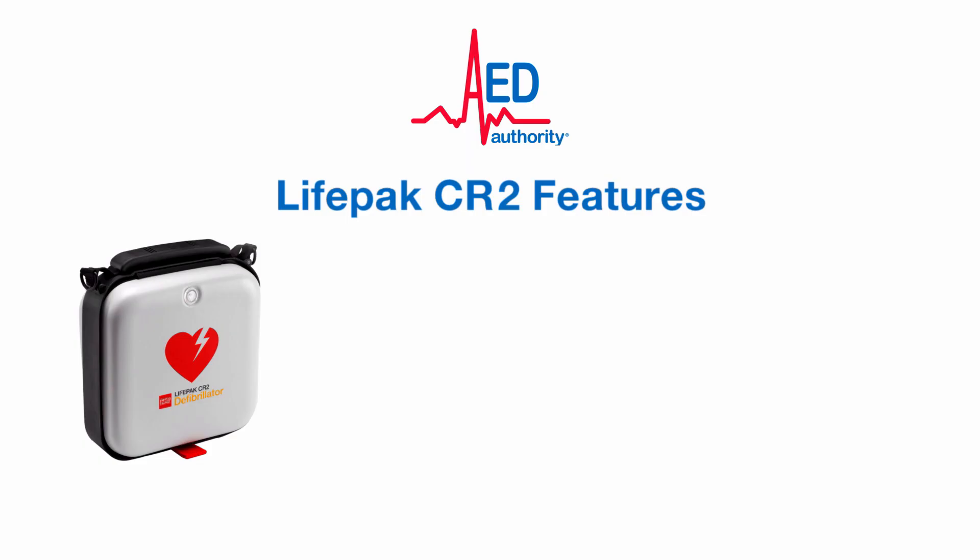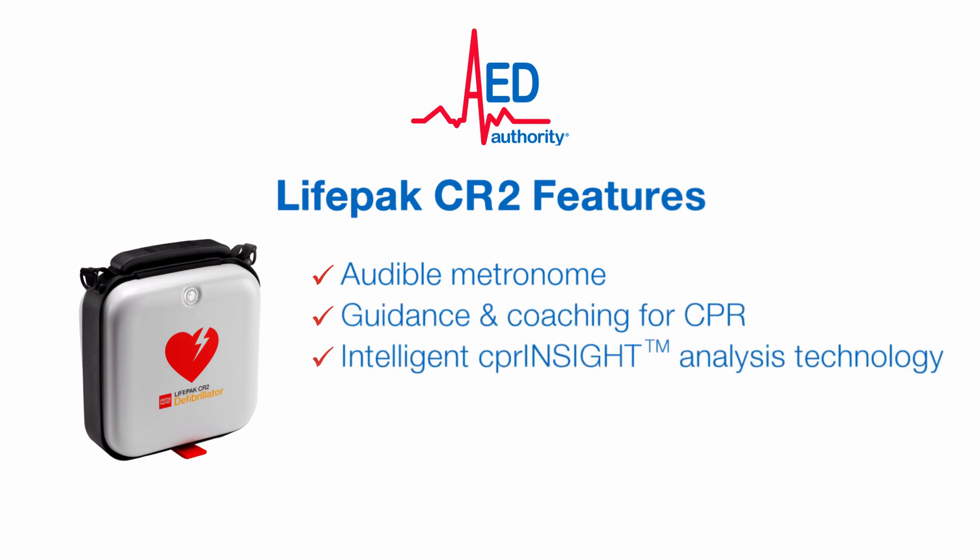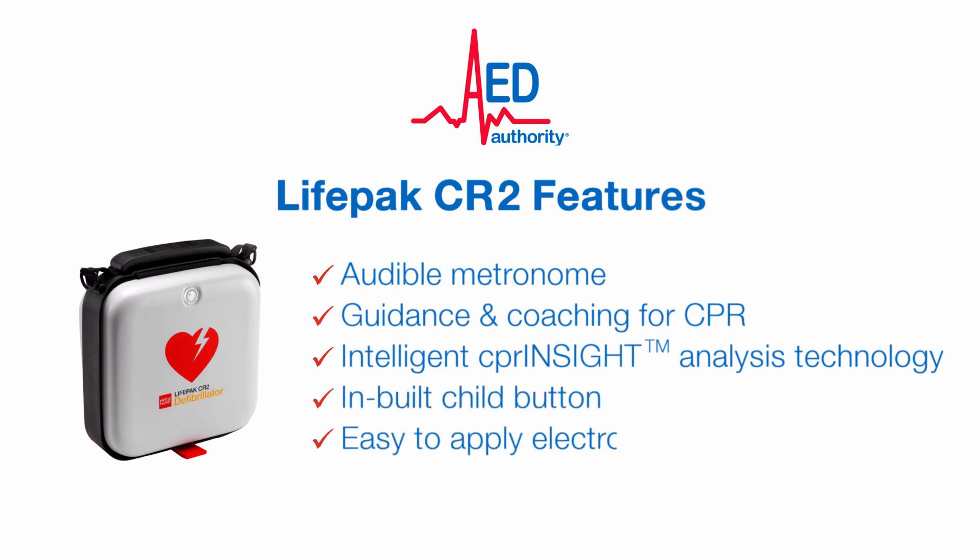The LifePak CR2 features an audible metronome, guidance and coaching for CPR, intelligent CPR insight analysis technology, an inbuilt child button, easy to apply electrodes and Wi-Fi connectivity. The CR2 will alert you via email if it requires maintenance.